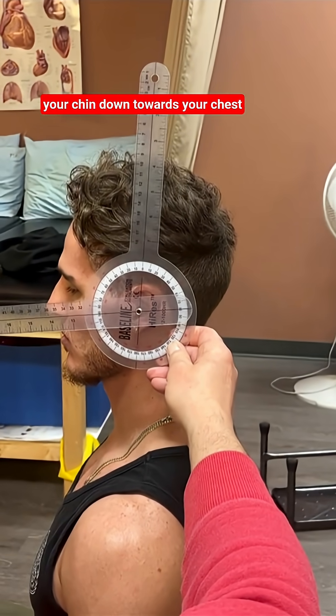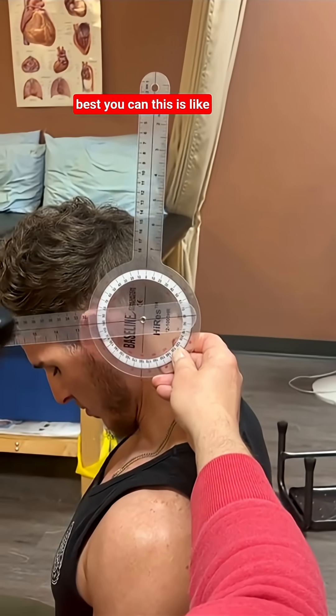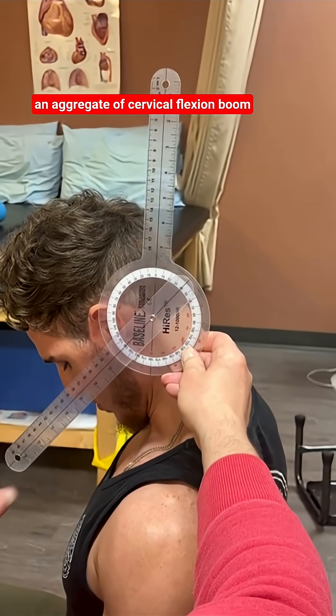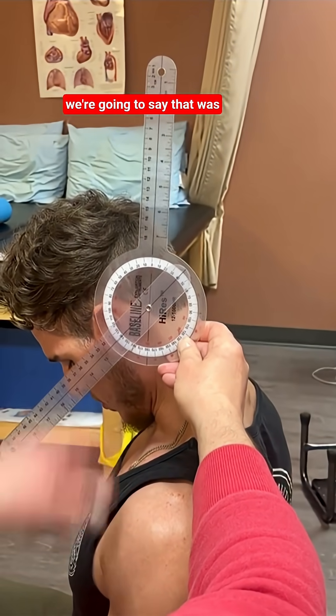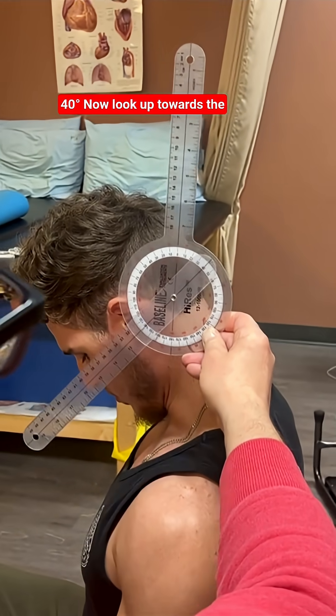So, Travis, if you could take your chin down towards your chest best you can. This is like an aggregate of cervical flexion. We're going to say that was 40 degrees.